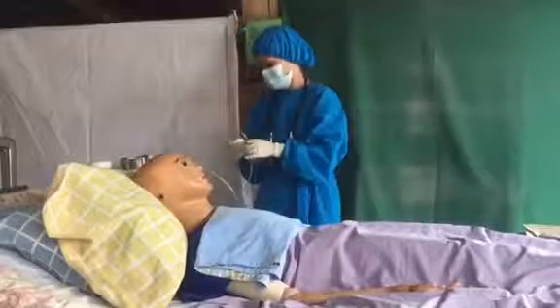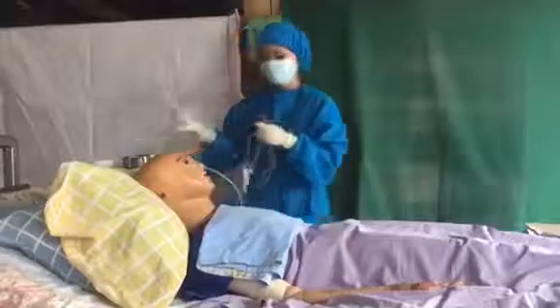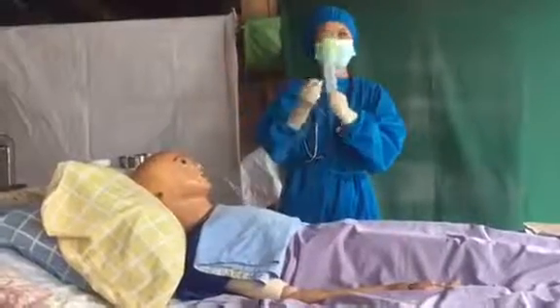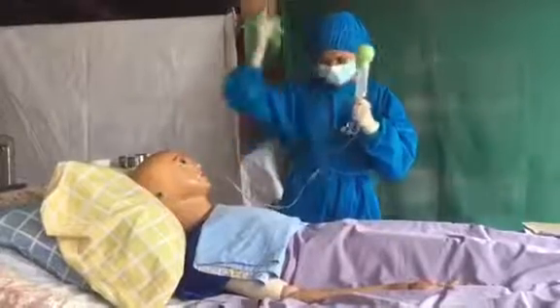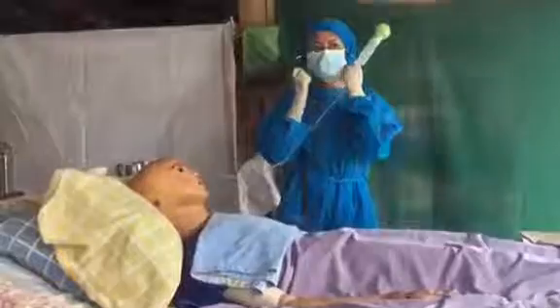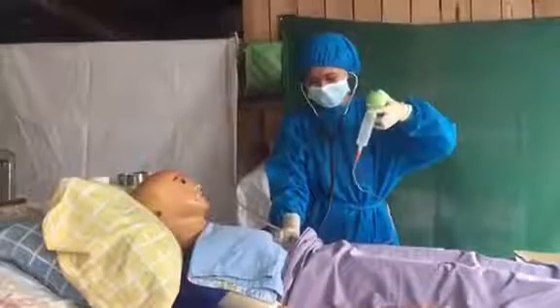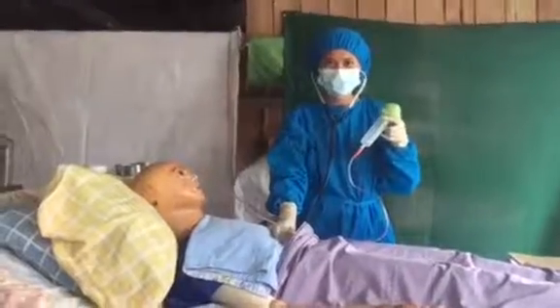And then check if the tube is in the proper place in the stomach using a stethoscope and a syringe. Make sure that you lock the tube. Introduce air by pumping the valve. And if you can hear the gurgling sound, that means that the tube is in the right place.